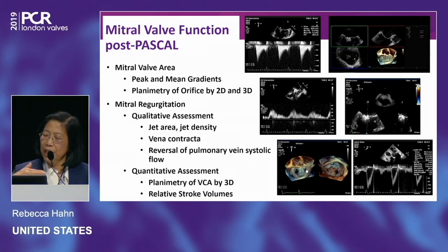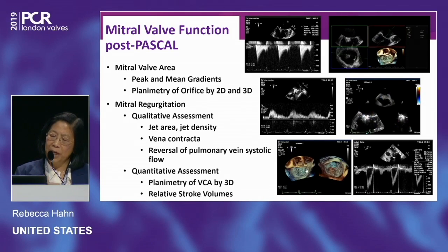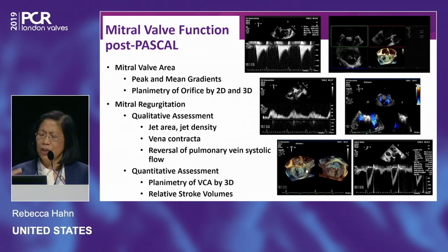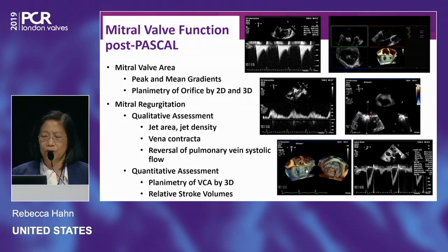So now when you're scanning across the commissure, remember this is just, we believe, just lateral to the midline, you can now just push the device in to go lateral, pull it out to go medial, and it makes it much, much easier. And so we do all of that using three-dimensional imaging prior to the study.